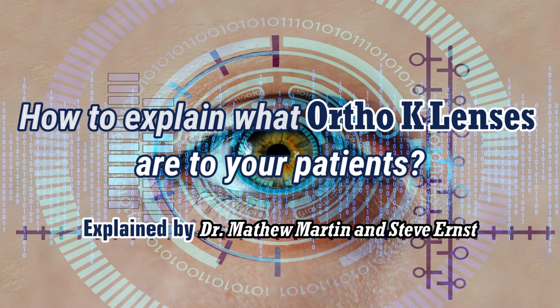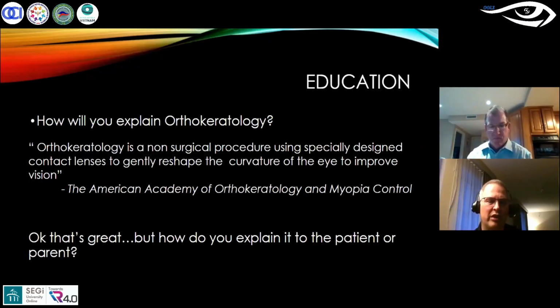I think it's important for you to think about how you're going to explain orthokeratology to your patient. The American Academy of Orthokeratology and Myopia Control defines orthokeratology as a non-surgical procedure using specially designed contact lenses to gently reshape the curvature of the eye to improve vision. I think that's awesome. It's a great technical description of what's going on. But I want you to be able to break that down and simplify it for your patient.